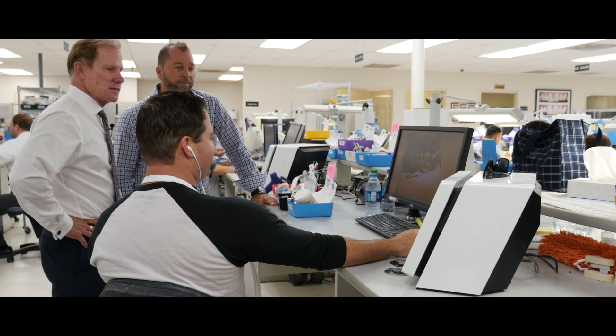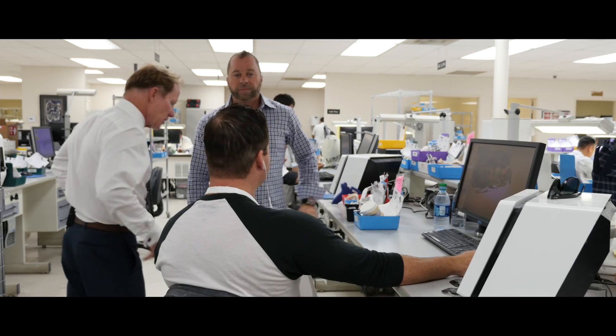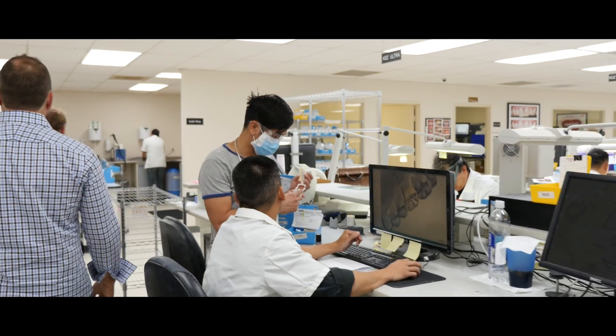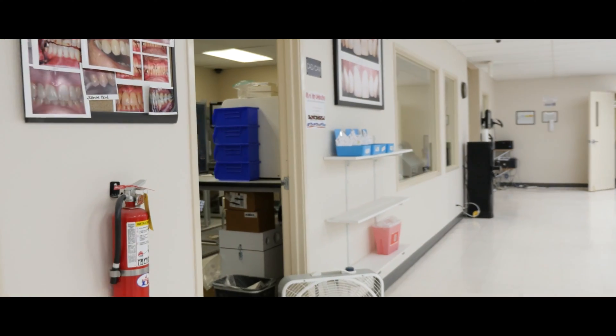It's pretty pricey, so that's probably the main reason. All right, finish our tour. Good to see you, man. Take care. So they'll design it, send it over, and then it's sent here.